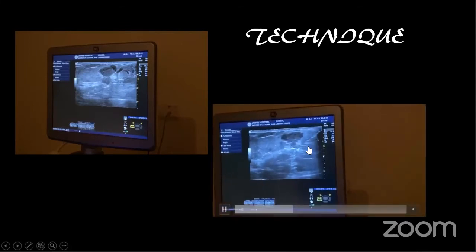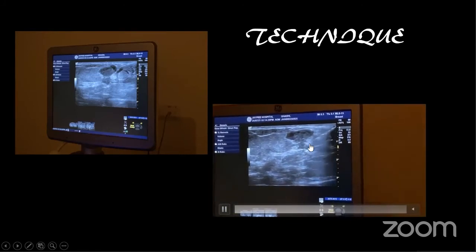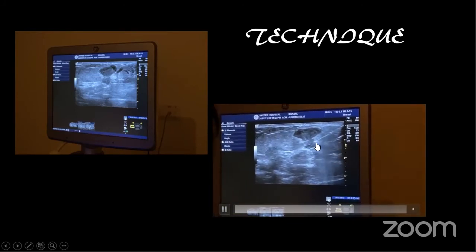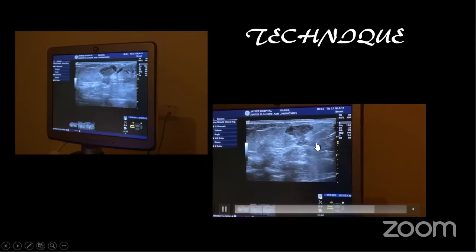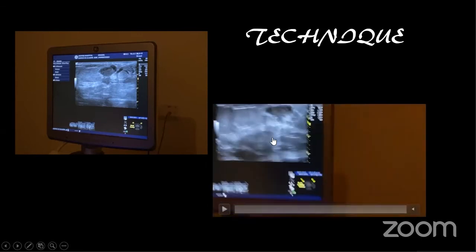And see, we can see the needle well. When the lesion is smaller, we can keep the needle at the periphery, because the throw of the sample notch is about 2.2 centimeters, and then fire it from the periphery. Or if the lesion is bigger, we can keep it anywhere within the mass also.